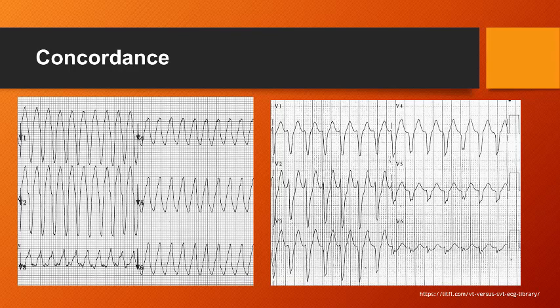Rarely, supraventricular tachycardias with the left bundle branch block aberrancy will demonstrate negative concordance, but there is almost always some evidence of an R wave in the lateral precordial leads in those cases. Where the presence of concordance strongly suggests VT, that is having a more than 90% specificity, its absence is not helpful in diagnosis. Its sensitivity is approximately around 20%.